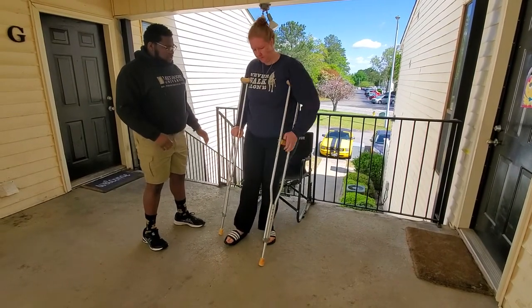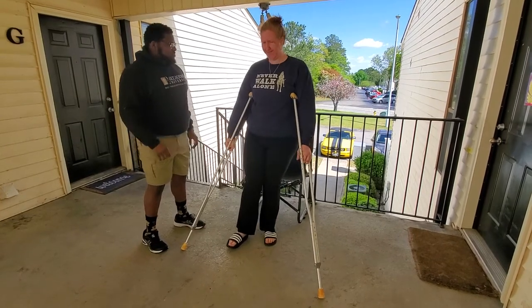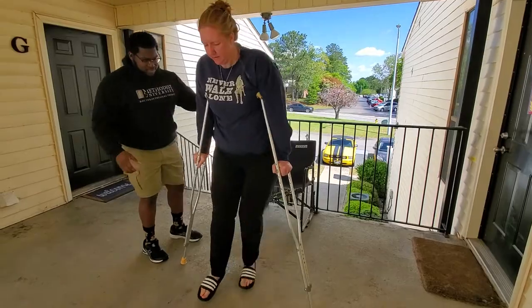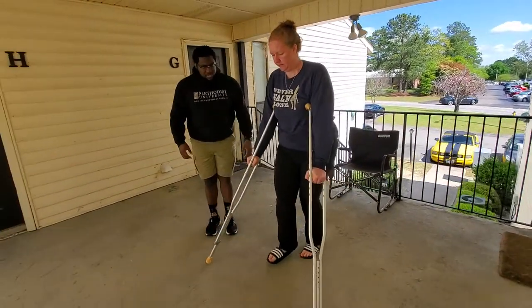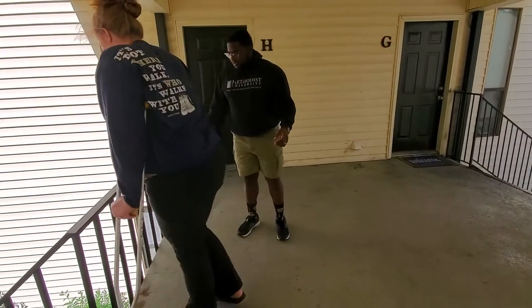Now switch your arms over. I'll cue you a little bit. The crutches are on the side. Step through and then hop. One, two, three. One, two, three. One, two, three. Keep minimal weight on that front leg.